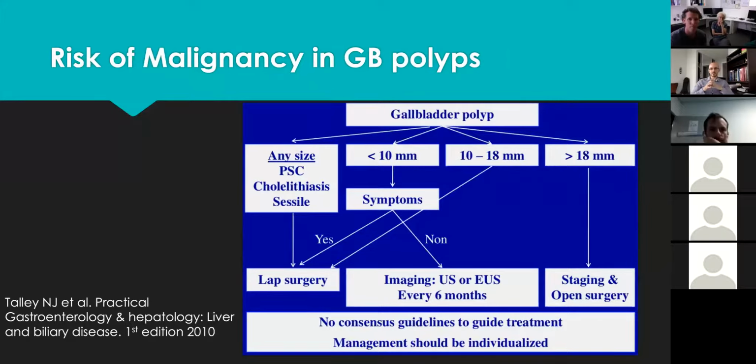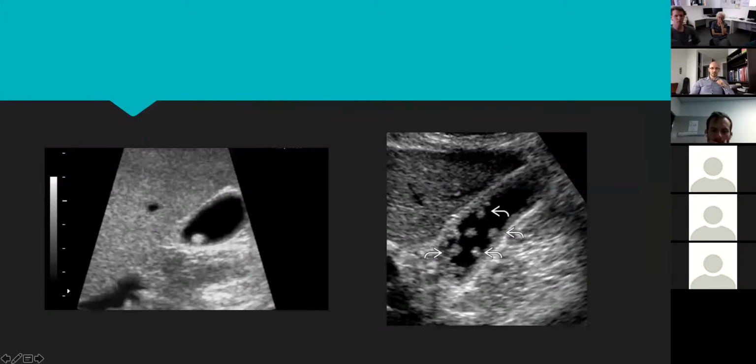Yeah, so with the polyps, there is another thing. If you can imagine, they are usually in the middle of the gallbladder. So if it is a stone, usually when you change the position, you can see all of those stones just move and go into the dependent area. When the patient is supine, you can see them lying pretty much there, like that image that we had earlier.